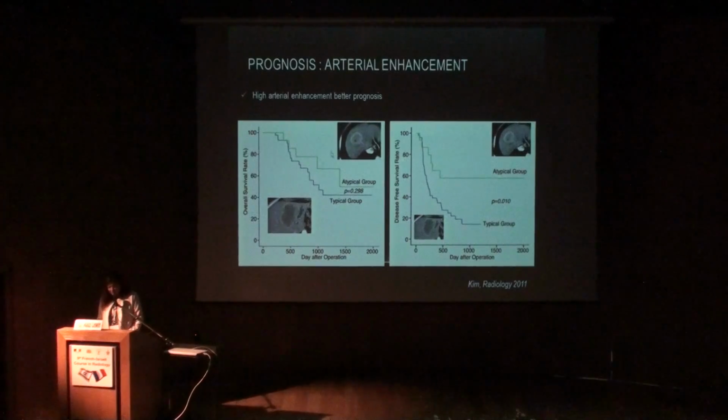And if we compare these two groups of patients, these authors show that you have really a better prognosis if you have this atypical enhancement on arterial phase than if you have a typical enhancement, in terms of overall survival and in terms of disease-free survival rate.